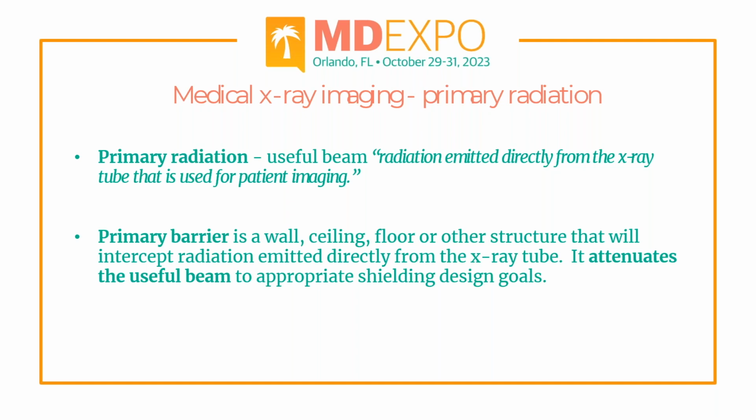So what is primary radiation? We're going into X-rays here without going into too much detail. It's that useful beam that comes out from an X-ray machine directly from the X-ray tube, and that is used for the imaging of the patient.